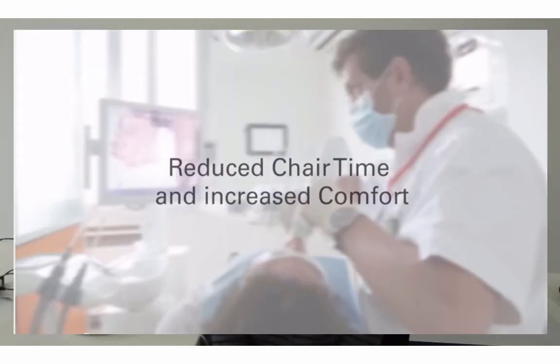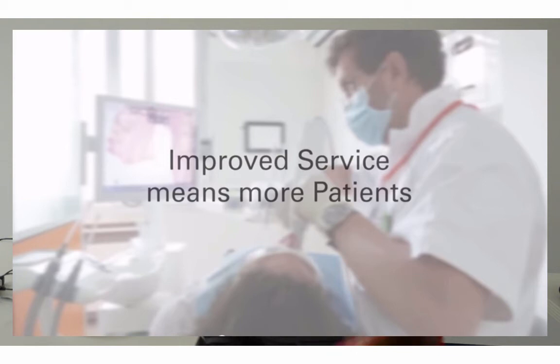In conclusion, the ThreeShape digital impression system is the best on the market for many, many reasons. No matter which application you use it the most for, it will help reduce your chair time, increase your patient comfort, and provide quality services for your patients. By implementing the ThreeShape Trios into your practice, it's like a party in every scan.